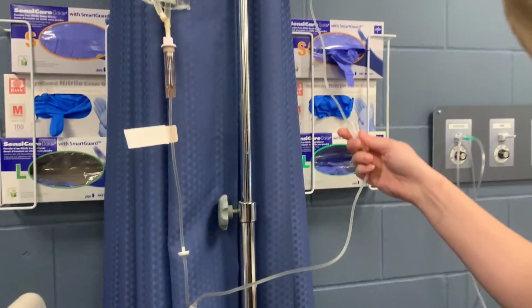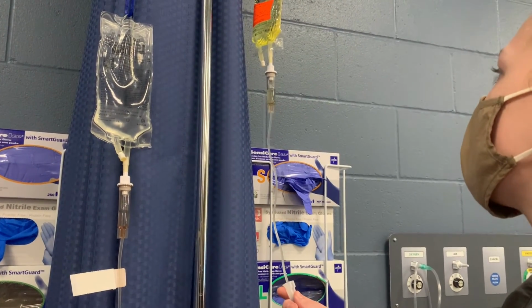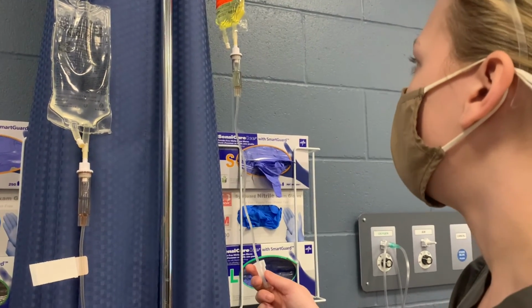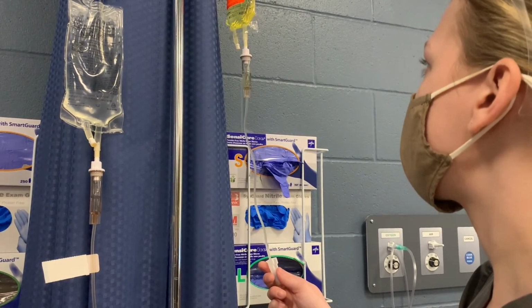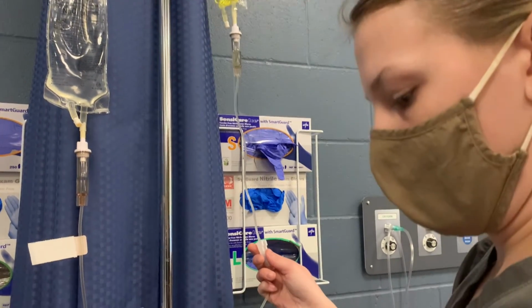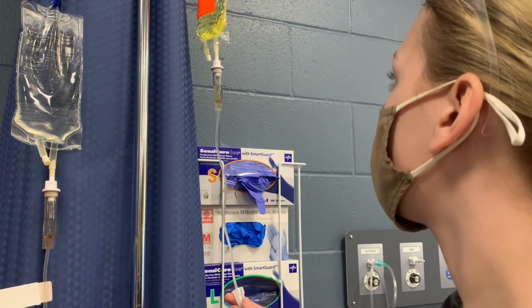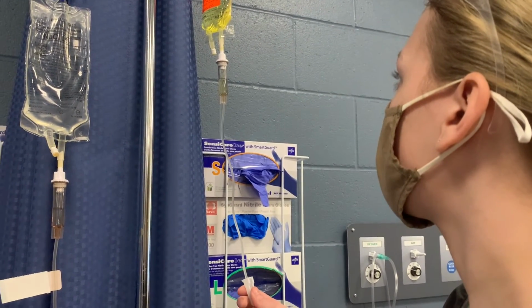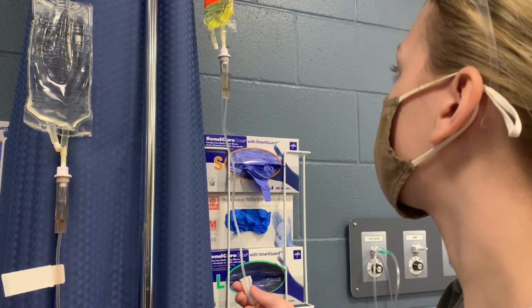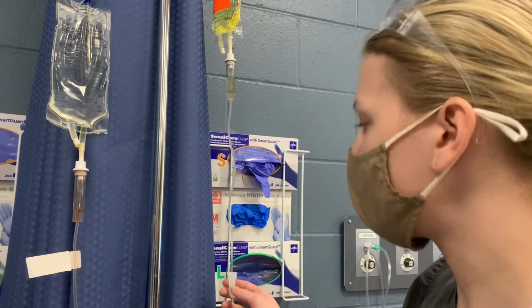And yeah, we're just gonna take it out so that you can see it drip, because it will take a little bit. So I'm watching. Perfect, so that's a good rate there. We're going at 35 drops per minute.